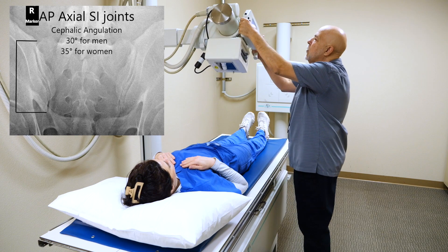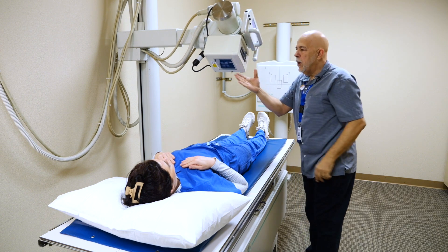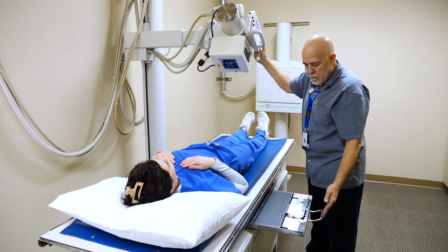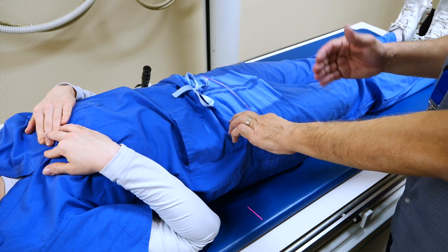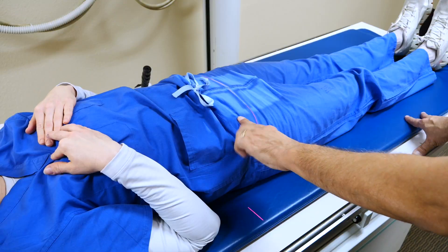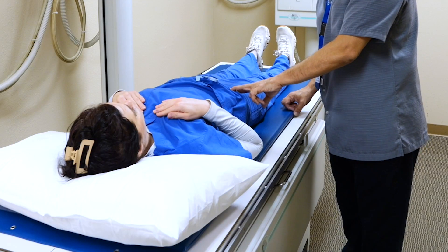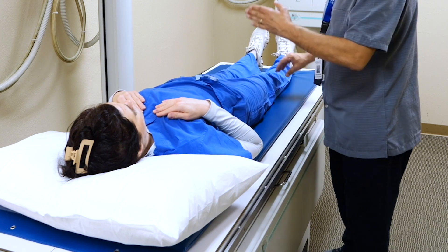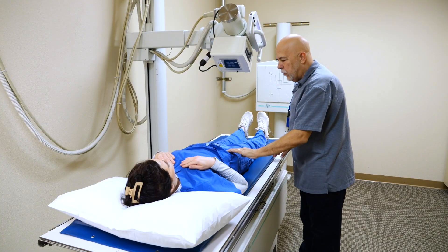She's a woman, so we're going to do 35 degrees angulation. I have already adjusted the height to make sure we're 40 inches at the correct distance. We're going to center to our IR. Our centering point is one and a half inches above the symphysis pubis. Our centering point will be two and a half inches below the ASIS, which is one and a half inches above the symphysis pubis. You can palpate the greater trochanter by rotating internally and externally, and that will be at the level of the symphysis pubis — so one and a half inches above that.